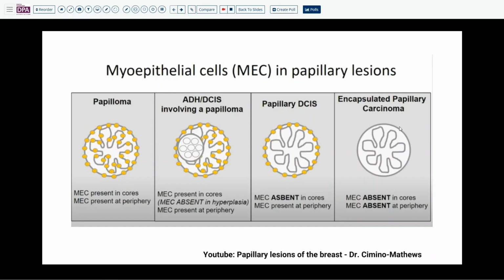If you can see any high-grade cytology forming this architecture, usually we need to put a comment to give a suspicion to the provider that we could not just treat this high-grade carcinoma as a Tis.